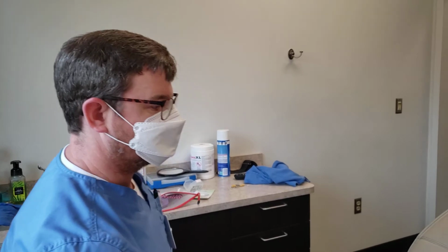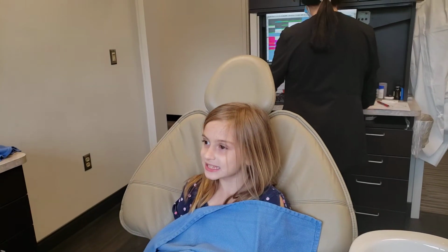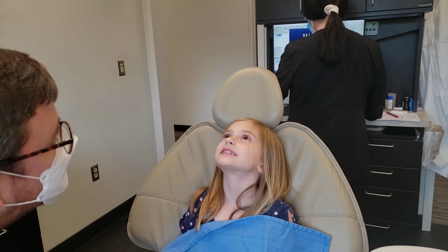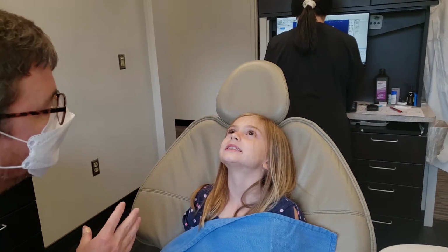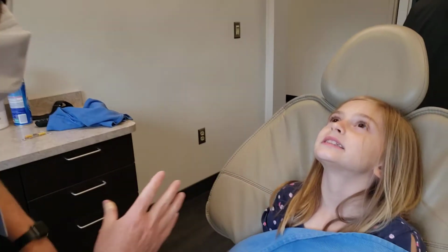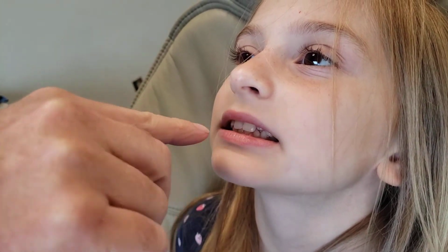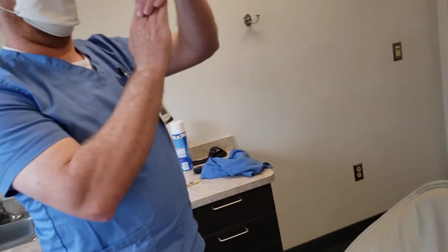Okay. So let me see. Smile real big. Open wide. Look up. Bite down. So there will be a time where maybe her bite, she can't figure out exactly where it's wanting to go. Smile real big. All right, bite down. So right now I'm looking at the overbite and the overjet, and within about 6 months, where you can barely see her gum down here, you'll actually be able to see at least half of the bottom teeth, and that'll show us that it's correcting.